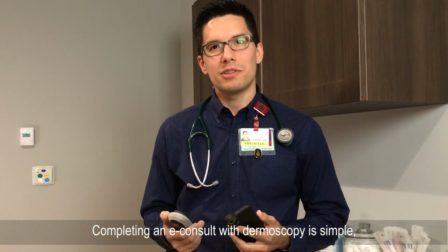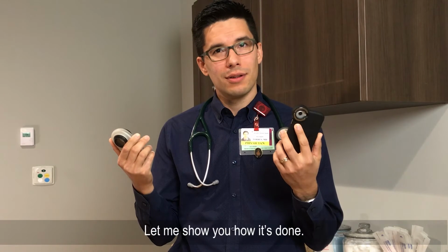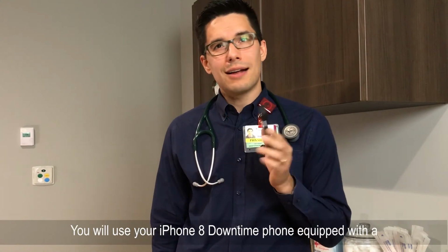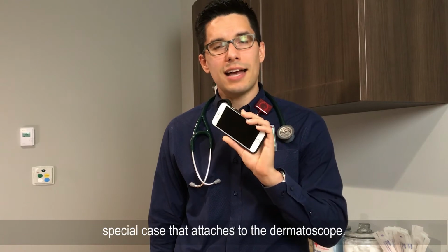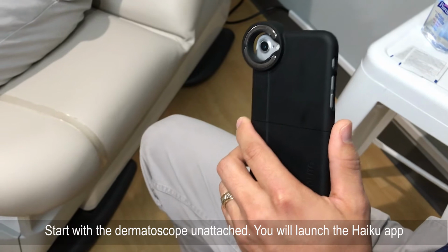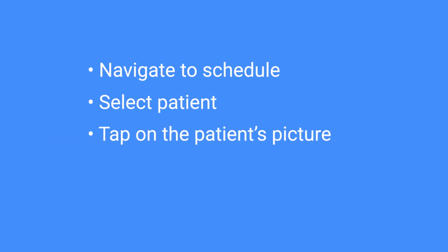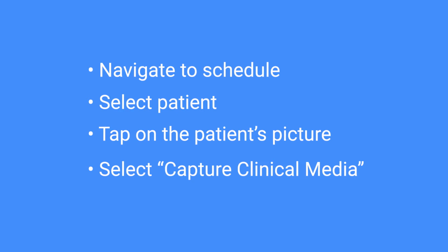Completing an e-consult with dermoscopy is simple, and all it takes is an iPhone and a dermatoscope. Let me show you how it's done. You will use your iPhone 8 downtime phone equipped with a special case that attaches to the dermatoscope. Start with the dermatoscope unattached. You will launch the Haiku app that's already loaded on the phone. Navigate to your schedule and select your patient. Tap on the patient's picture and select Capture Clinical Media.